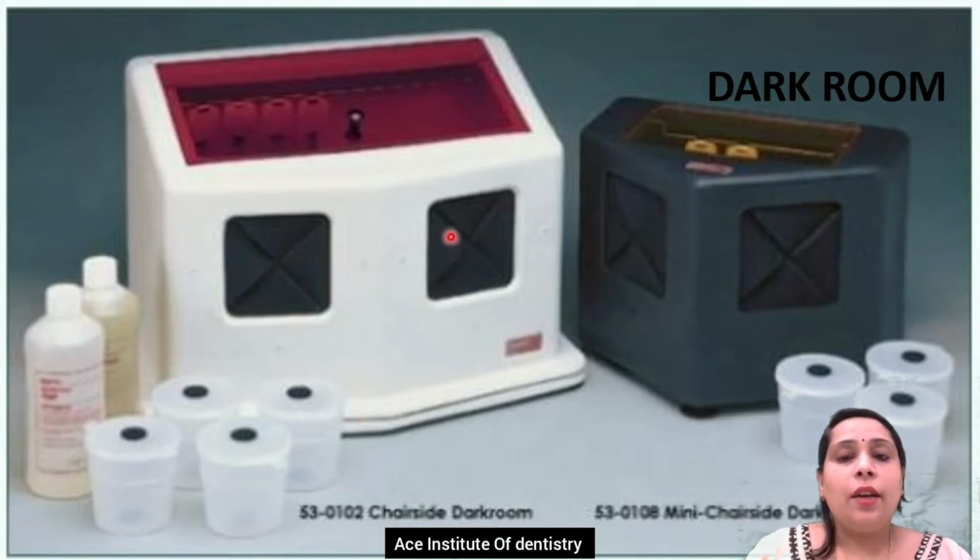First, inside you have to open the film and hold it to the pin. Then from the top you can see and dip it into the first developer and wait for 10 seconds. It usually depends upon the mixing and the quality of the developer you are using. If it is a fresh mix, then usually 10 seconds is sufficient. Then once it is done, remove it, and inside you'll be having a red light. From that you can see the image. If you are able to see the proper image, that means it has been developed.